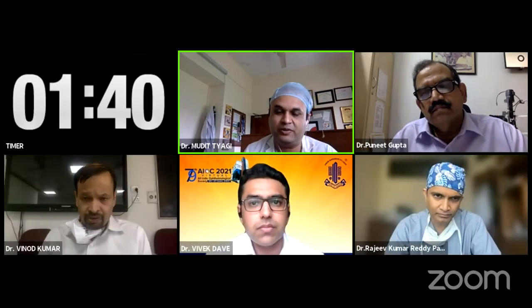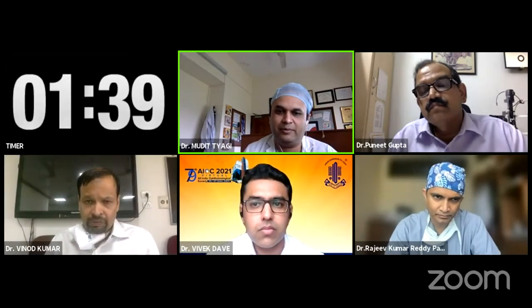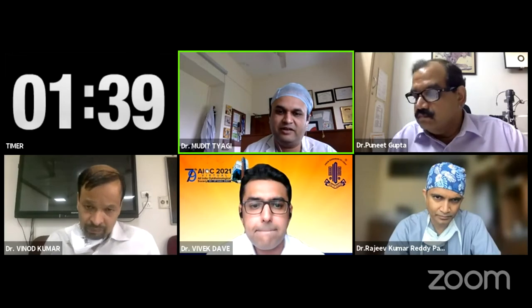Yeah, so there can be. If you are too close to the disc and illumination is too high, you can still perceive a false pallor in some of these cases. Therefore it makes sense to withdraw your endoscopy illumination a little bit and then visualize the disc. Because if you are very close to the disc, the illumination in itself will mask your findings and you may end up thinking that the disc is unnecessarily too pale, whereas it might not be. So it makes sense to just withdraw your endoscopy light pipe a little bit back and then visualize the disc again.